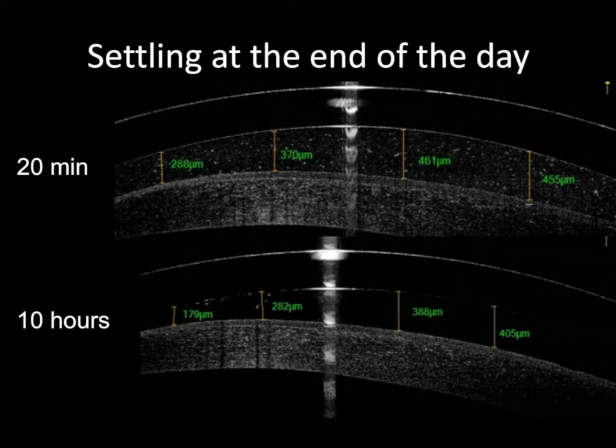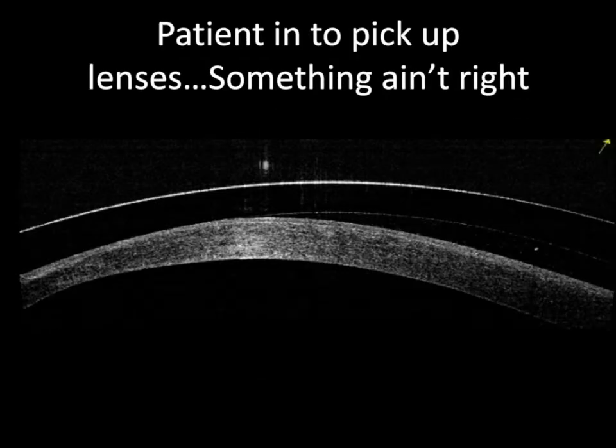This is an individual who actually came in to pick up their contact lenses at our office, and there were 2 people that were picking up scleral lenses that day, and unfortunately, the wrong lens was dispensed to this individual. Before I even walked into the exam room, because the anterior segment OCT is taken prior to me entering the exam room, I can actually see that the posterior surface of the lens is abutting the cornea, and that's just simply not supposed to be happening. So I immediately checked the lenses, and I knew that we had to switch the lenses on those patients.